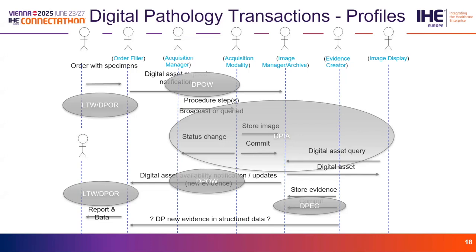So that represents an advancement over where we are today, where in digital pathology, the end user has to look at the label to identify what they are actually looking at. Otherwise, for example, immunohistochemistry for estrogen receptor or progesterone receptor look identical. A pathologist is not able to tell them apart, save for looking at the label.